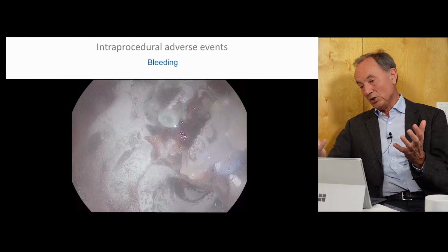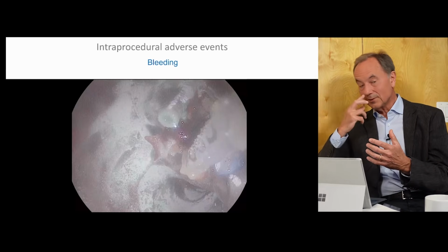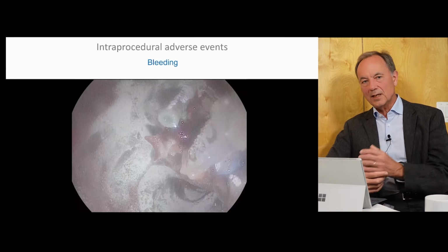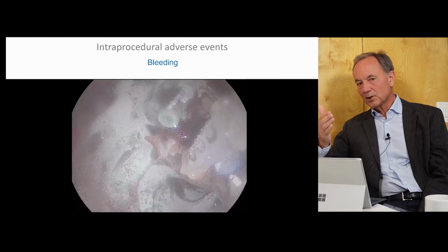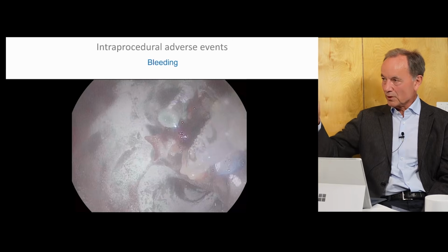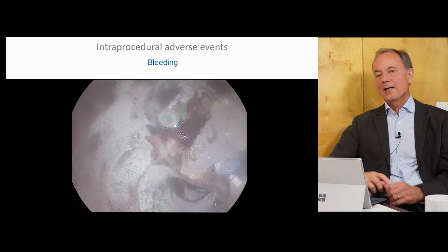And we just mentioned we shouldn't coagulate too much because of the risk of delayed perforation. We flush, we try to identify the bleeding site. We can use clips, but also with clips we have to be careful, because as with regular spontaneous sporadic duodenal adenoma, the wall is very thin, and when we use especially a large clip, then you can even cause a perforation. So I wouldn't recommend a large clip, but smaller clips.